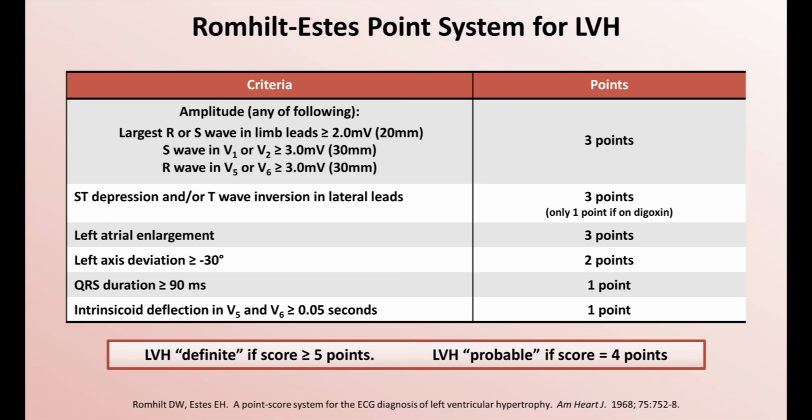While both literature and my personal experience suggest that the Romhilt-Estes score is more accurate than other criteria, the modest diagnostic benefit may not be worth its cumbersome nature.